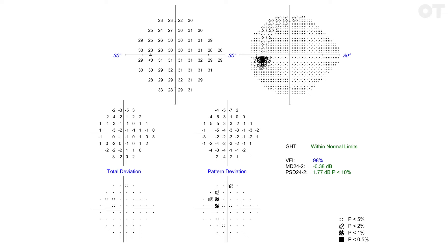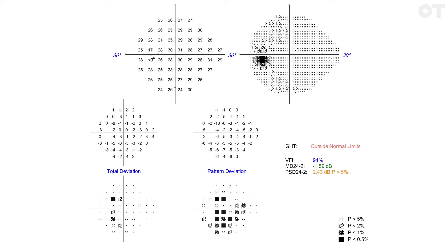If a patient has cataract, their whole hill of vision will be reduced on the total deviation plot, but the pattern deviation shows points that are further depressed compared to their own general performance. Again, the same probability representation is used to show statistically abnormal points.